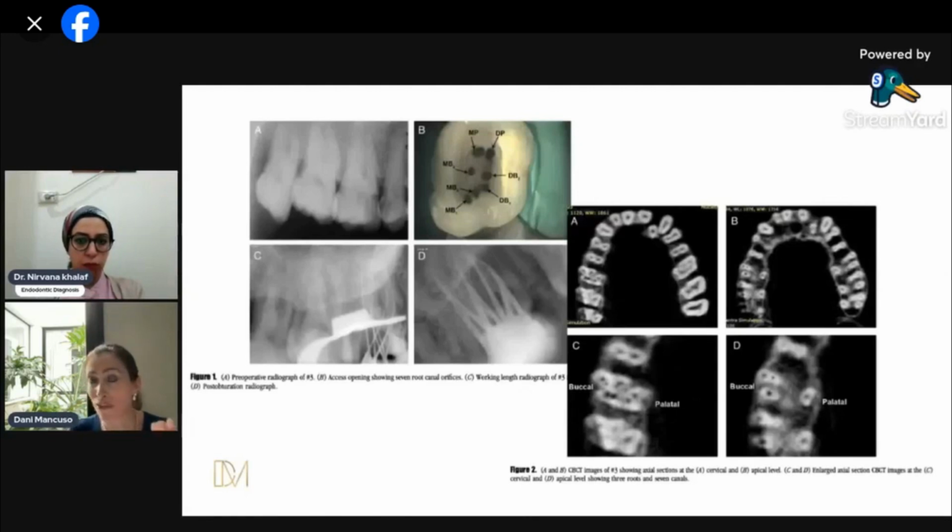Most of the times they fuse into one. However, there are cases that you see lots of separated apices as well. So you need to be careful, because you never know if they join or not. Then you need to prepare them all.